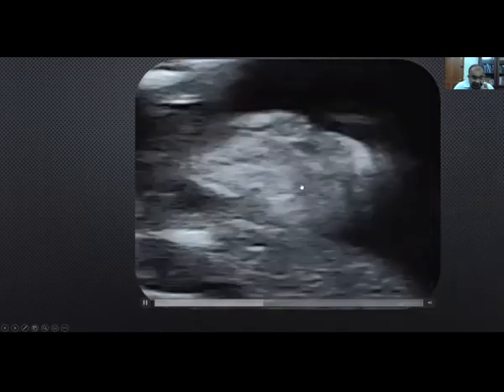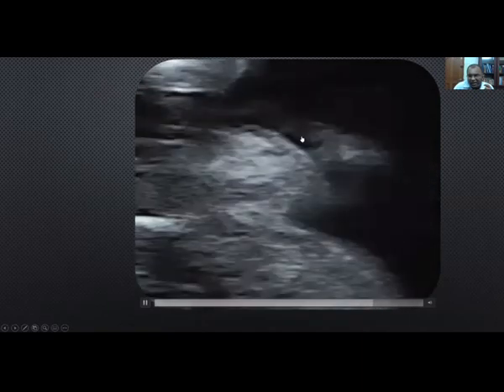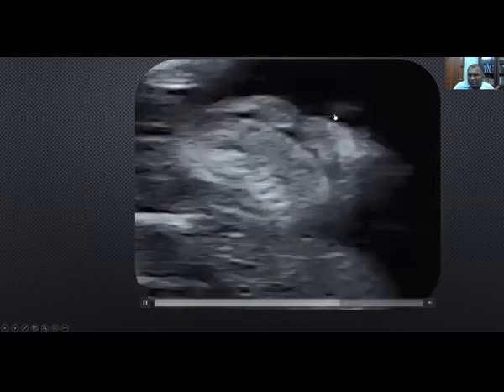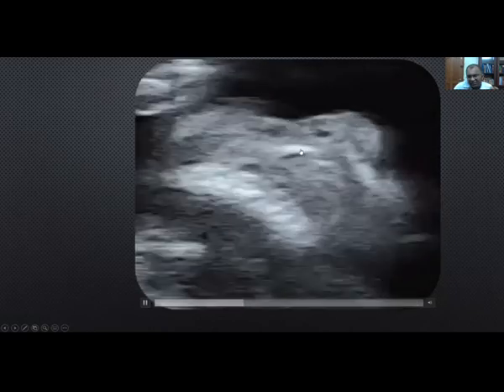For example, let's look at this anterior coronal view. You can clearly see a deficiency in the skin mucosal line over here. There is an interruption over here, suggesting there is some cleft, though the morphology of the nose, the shape and symmetry of the nose, is well preserved. There is a disruption of the integrity of the skin mucosal line in this region.